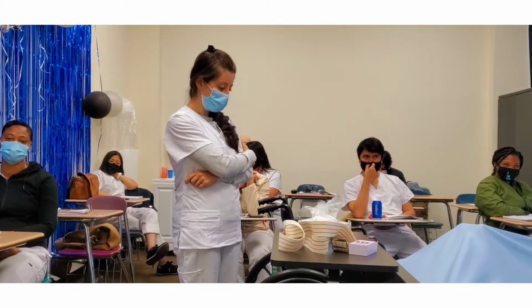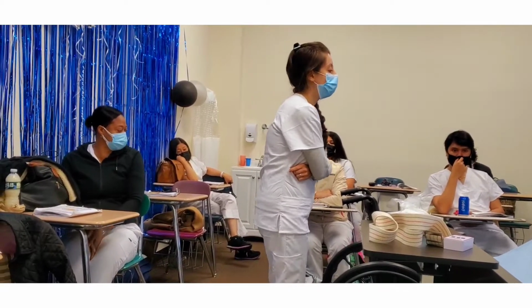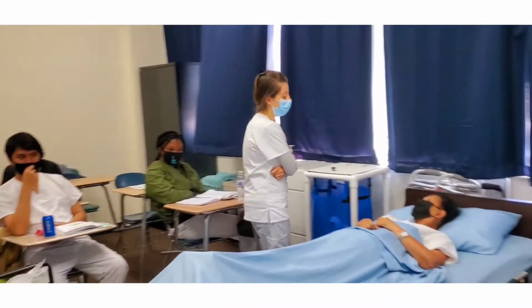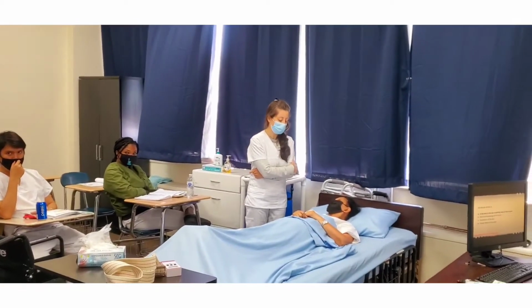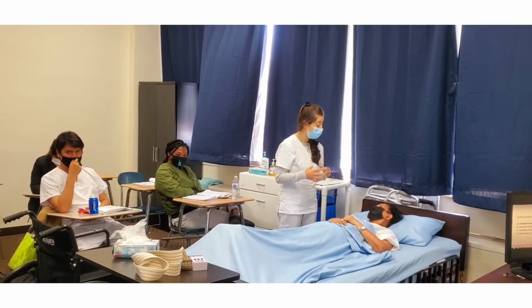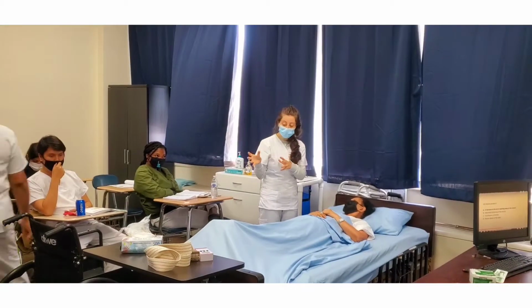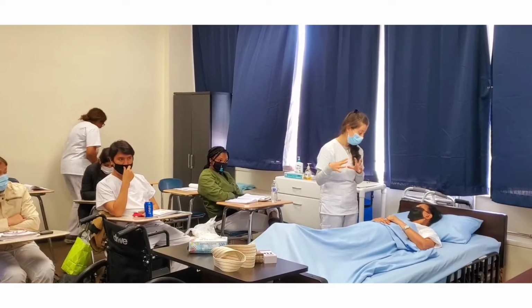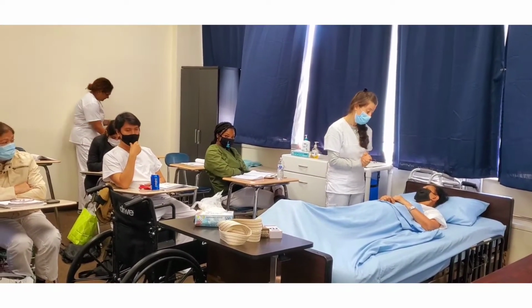Go ahead, Michaela. Miss Carpio, can I come in? Yes, please. Good morning, Ms. Carpio. It's me, Michaela, your home health aide again. How are you today? I'm okay, thank you. That is always good to hear. Ms. Carpio, I wanted to know if you were feeling up to standing up with me, getting a little movement to your wheelchair, getting you out of your bed, and seeing if we can take a little 10-step walk. Is that okay with you?